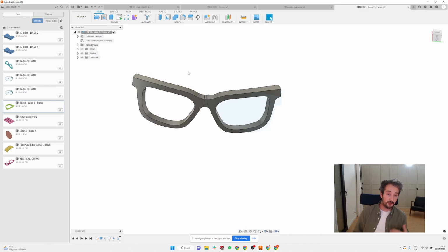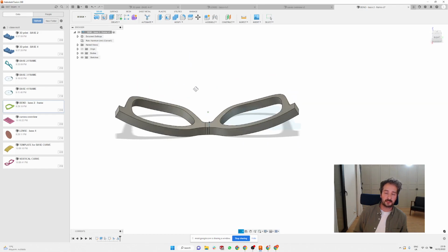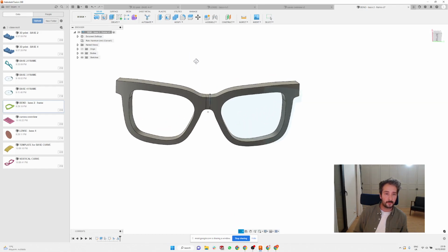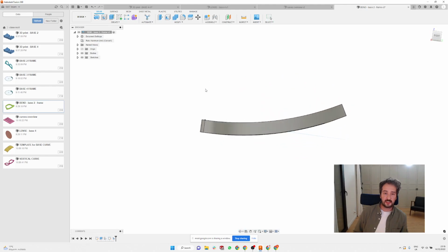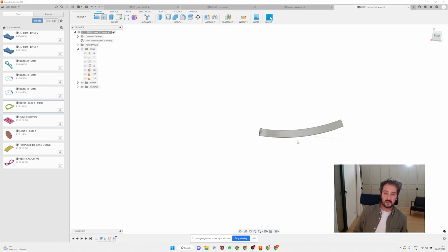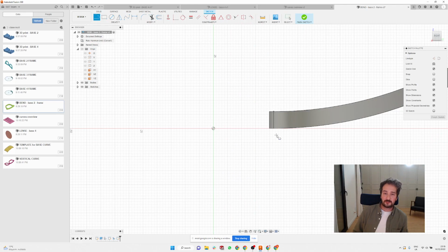But if you want this frame and you don't want a base 4, because you can see that it's quite a big curve and it might not actually fit this frame, the best way is to delete this mirror and create yourself a little helping sketch and extrusion. So I'm going to open the origin and find this plane, X and Z, sorry, and create a sketch.